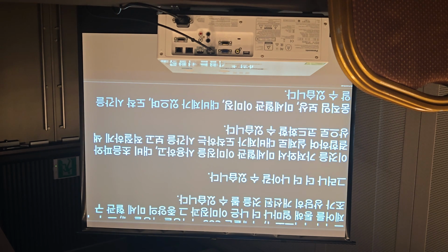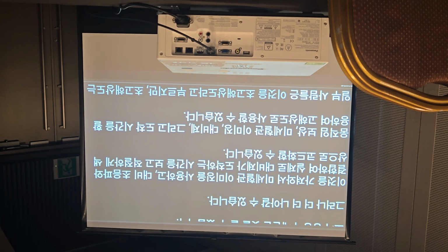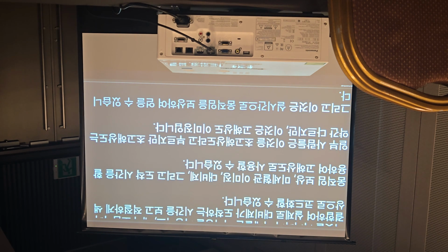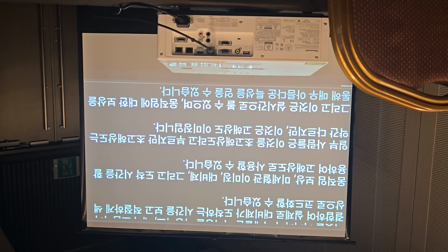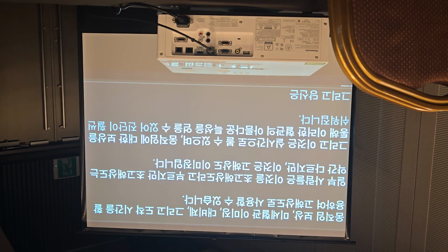Some people call this super resolution, but super resolution is slightly different, but this is high resolution imaging. And you can see for this that it's in real time with compensation for movement, and you're getting such beautiful characterization and movement of those vessels, which makes your diagnosis so much easier. And you don't need to ask the patient to breath hold to get these images.